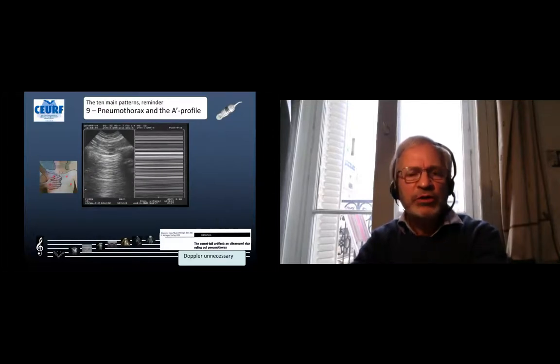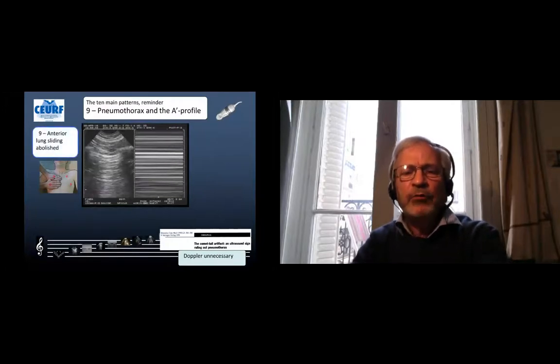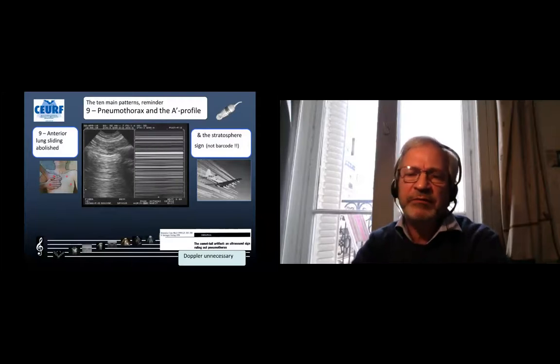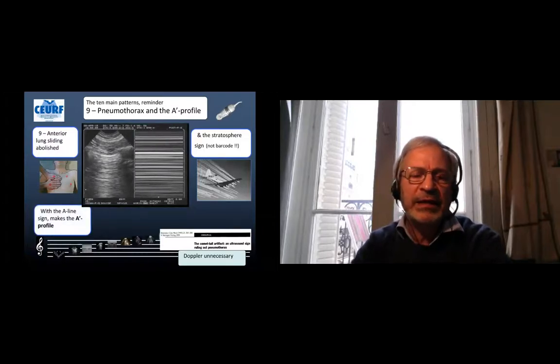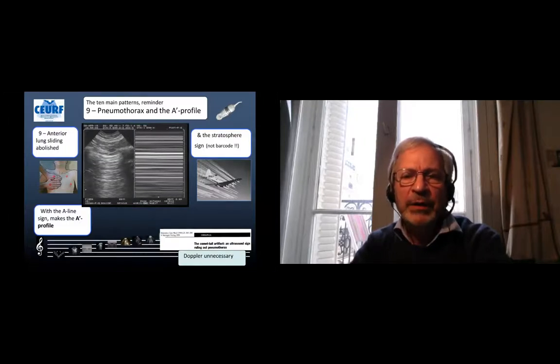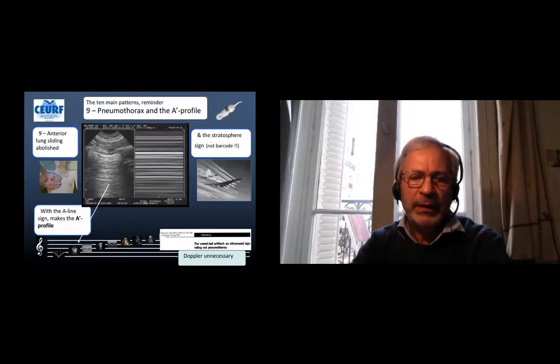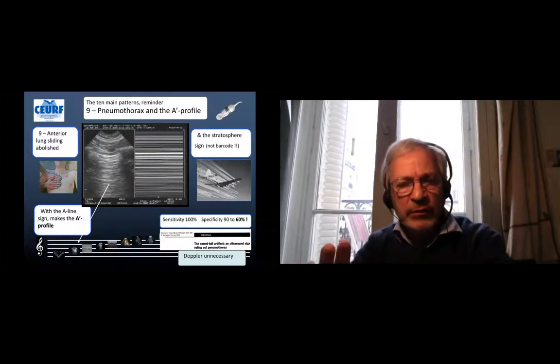And now we see what is the A-prime profile of the BLUE protocol. We can see a complete abolition at the left image of lung sliding anteriorly, which makes in the M-mode the stratosphere sign. It looks like stratospheric phenomena. And now I look carefully in the Merlin space and I see only A-lines, one A-line. Here we have the A-prime profile defined this way.